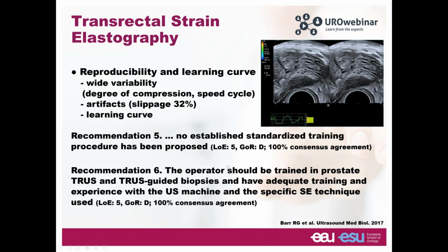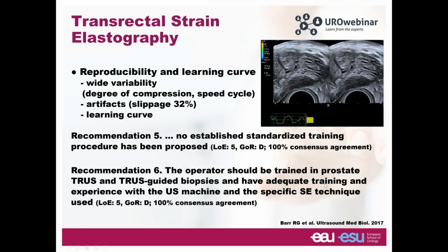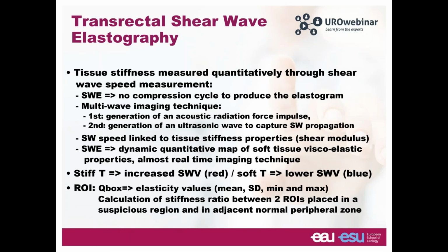The strain elastography requires quite a significant learning curve due to limited reproducibility, wide variability, and slippage artifact. So these are recommendations coming from the Ultrasound in Medicine and Biology paper from Richard Barr, showing that it is really necessary to get the most appropriate training.